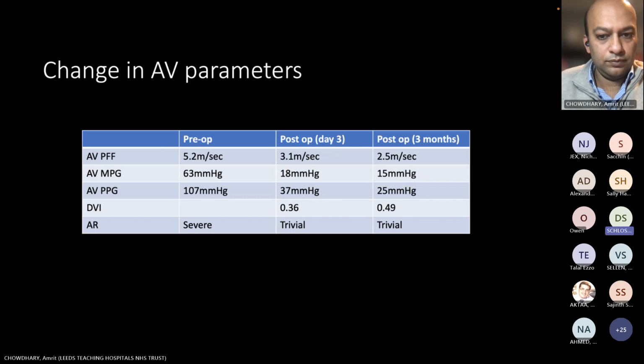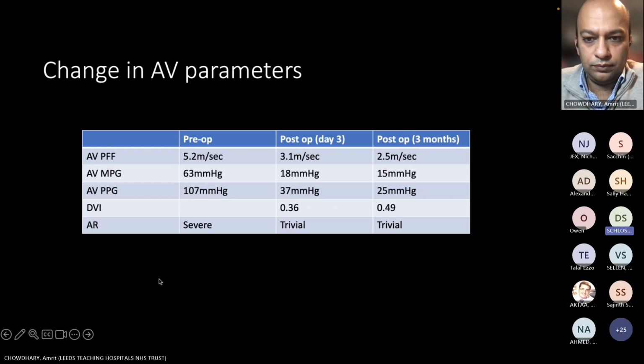So this was an interesting case where the fluoroscopy really was helpful to determine that there really was a problem there. Interestingly, if I put it into the valve PPM match, the 21 millimeter St. Jude's mechanical. As I said before, a 21 millimeter in a bioprosthetic valve is actually quite small, but as we saw on the Onyx valve, a 21 millimeter mechanical valve is probably not bad, and it gives you an EOA of 2 plus or minus 0.7. Peak gradient of 15, mean gradient of 8. So overall, not a bad valve, and actually his gradients there are okay, depending on his body surface area, obviously. So overall, that's a good result, but the patient was significantly ill.